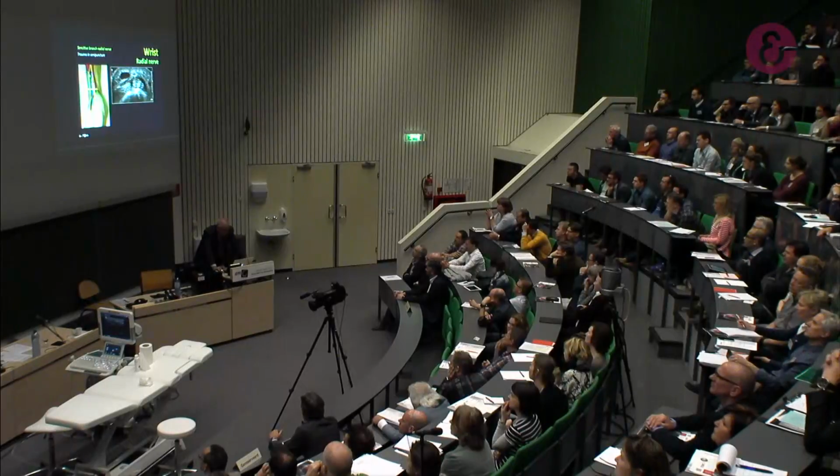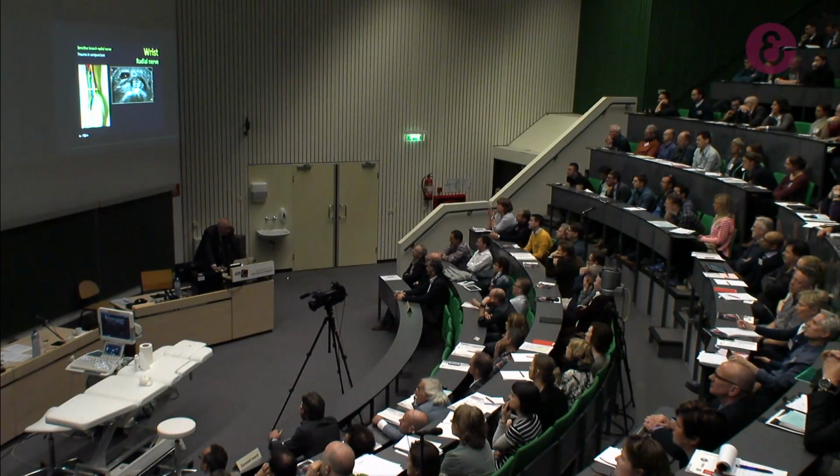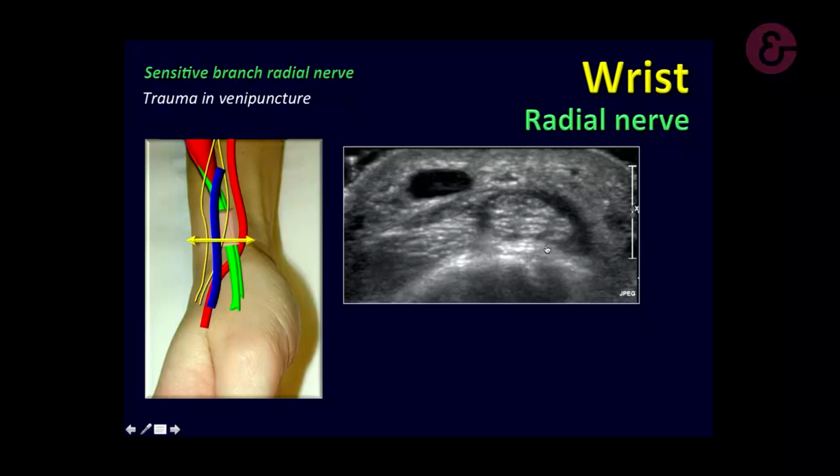When I was a student, I said to myself, this vein is bizarre. It is painful, the vein. No, it was the nerve. I put the needle inside the nerve. I have a lot of cases. This is the nerve. This is the vein. These are the extensor tendons. This is the radial, distal head.